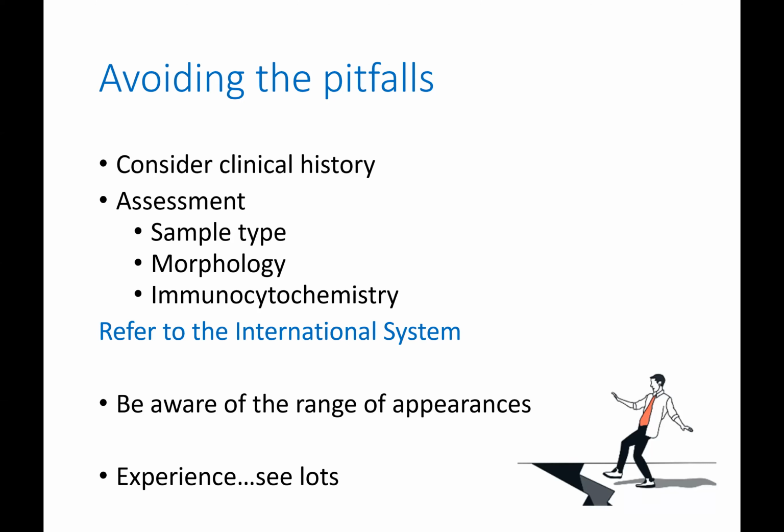But it's really important also to be aware of the range of appearances that can occur with various malignancies in serous fluid, and I think there's no substitute for experience and seeing as many cases as possible.